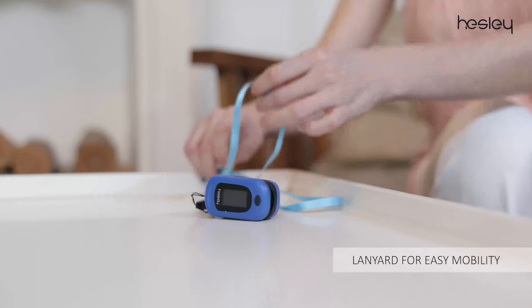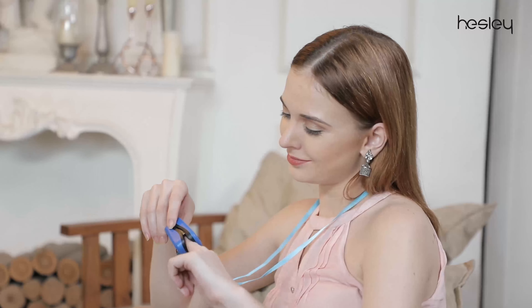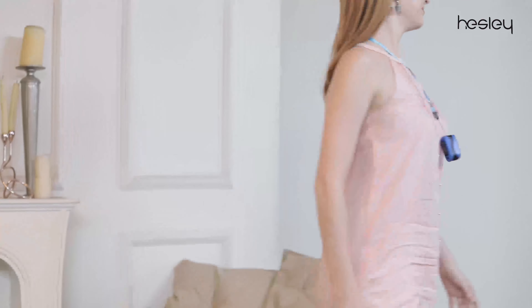It comes with a lanyard that makes it easy to carry anywhere. So when you have features like these in an oximeter, you can be assured of your health care.